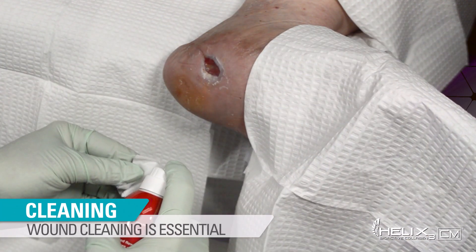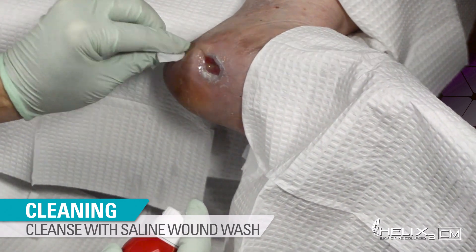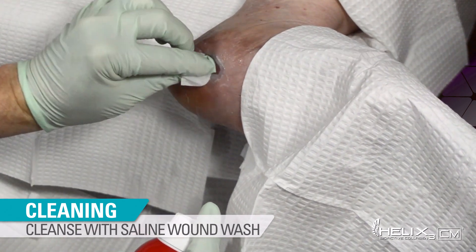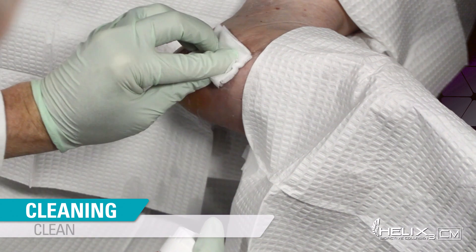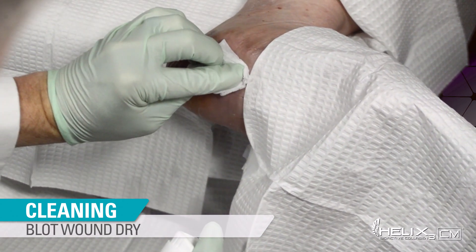The cleaning of your wound is essential. Cleanse the wound by spraying the affected area with Amerigel Saline Wound Wash, or apply Saline Wound Wash to a section of medical gauze and clean the affected area. Then gently blot the wound dry.